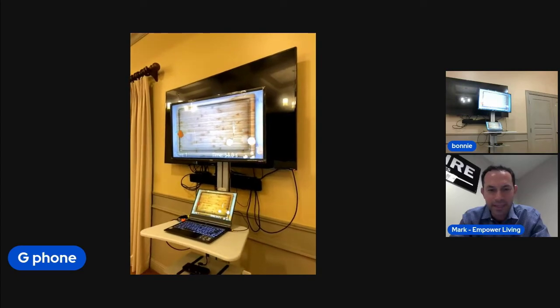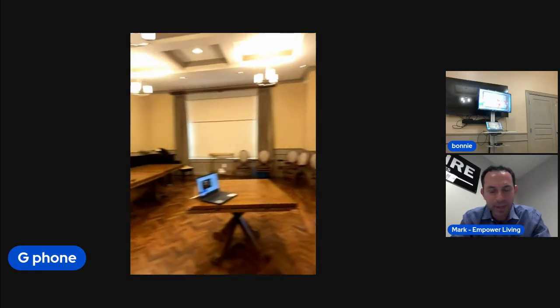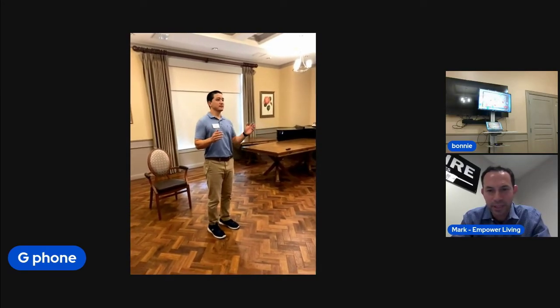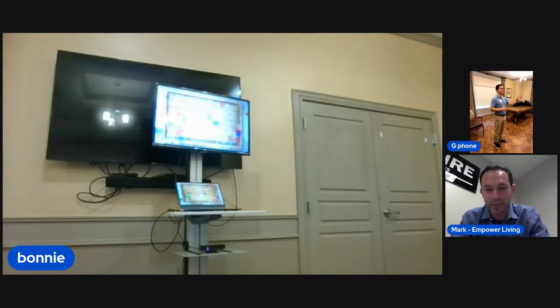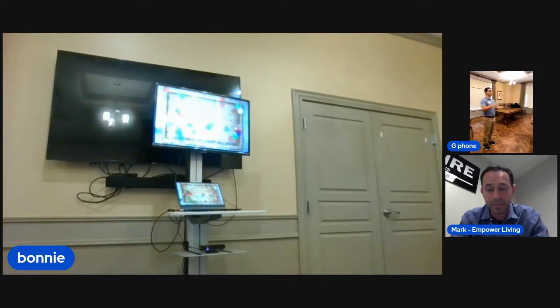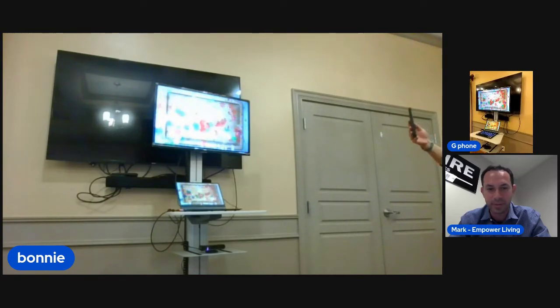What we're looking at is the veggie slicer. So you can't really see it too well here, but Gunnar is using his hands to slice the vegetables. And let's see if we could switch and see it better. So you can see right there, he's trying to hit the vegetables, but not hit some sponges. At the end, it's going to tell you a score. This is fun. I got to play this myself. It's good to, as you can see, it's movement, and we like movement. It may not get the heart rate up a ton, but it's using different movements to really start to broaden your range of motion, and it does help the blood pump.